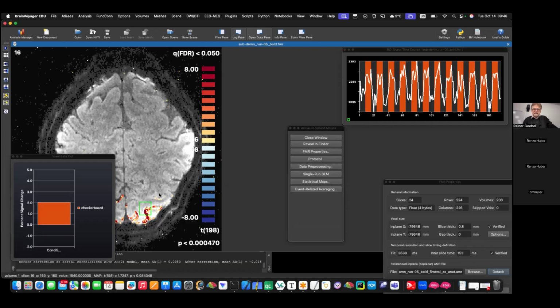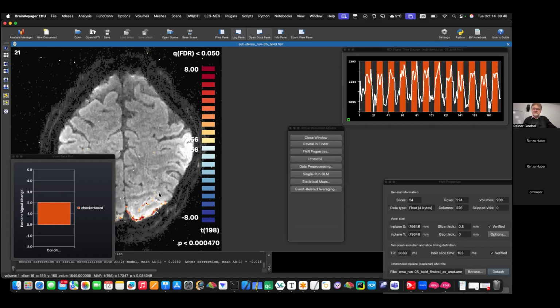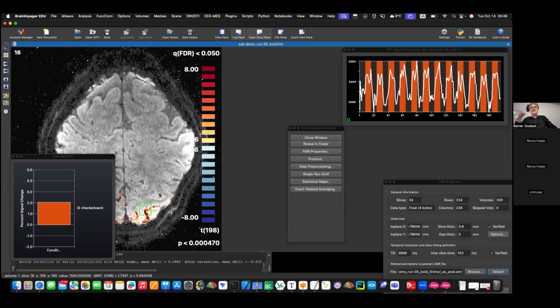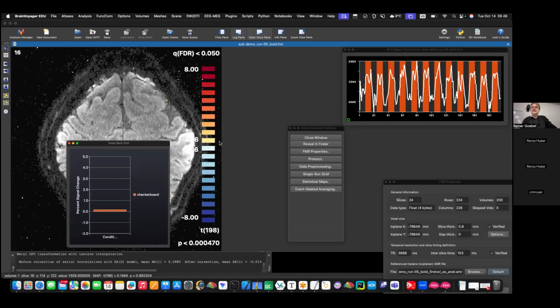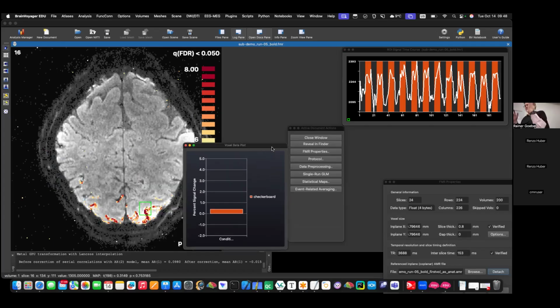But you're saying that this is on the motion uncorrected data. Exactly. Already at the motion uncorrected data, no high pass filter, it already looks that good. And it's just one run, right? Because you have such strong data, Renzo. It's fun because one run is kind of enough. Maybe not for Basel, but still, one for Goebel is enough for this paradigm.